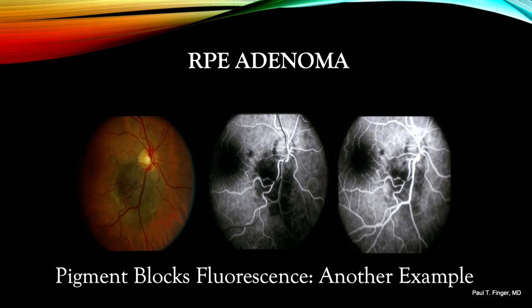Here is another example of pigment blocks fluorescence: this is an RPE adenoma. You see very little increased fluorescence through the duration of the study.